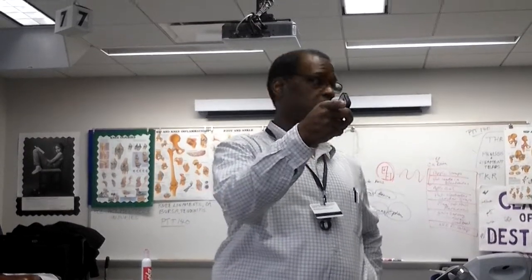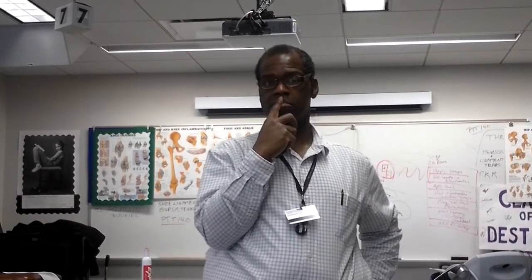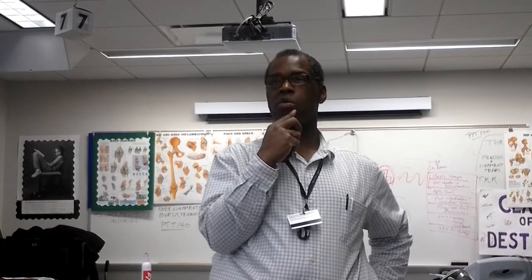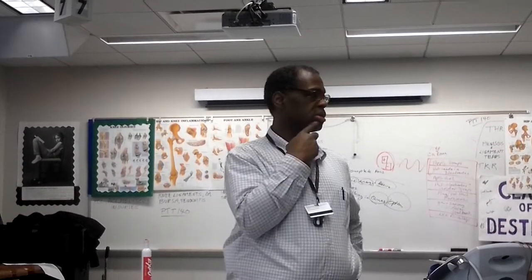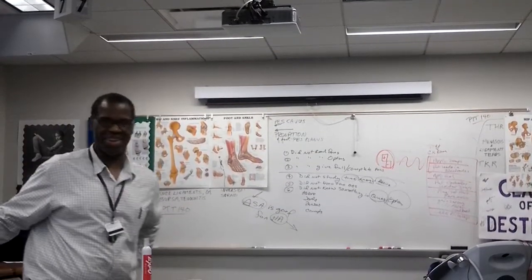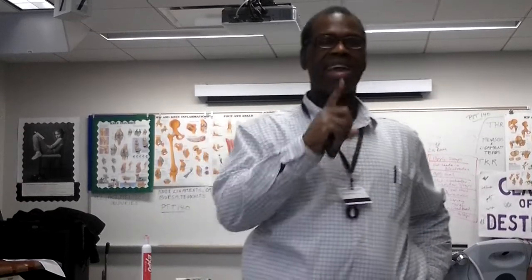All right. What is an active pad? What does that mean? It's where the current is felt. Where the energy is felt. What about a dispersive pad? It conveys the current to the active pad. There's no feeling under the pad. What makes it a dispersive pad? It's twice the size of the active, or more than two times the size of the active. I was going to say that next. That's a function.